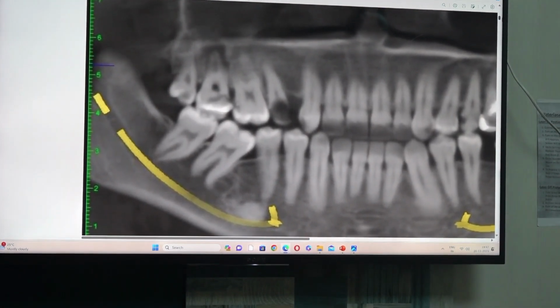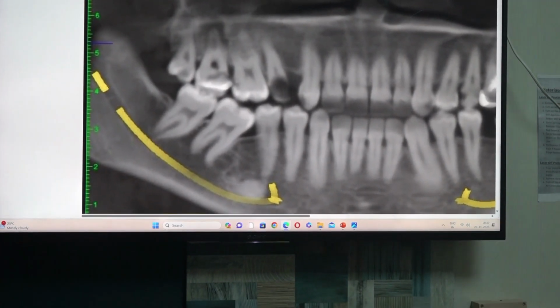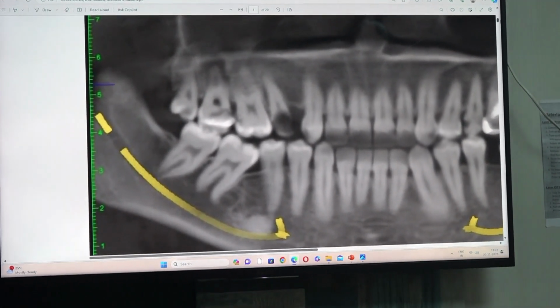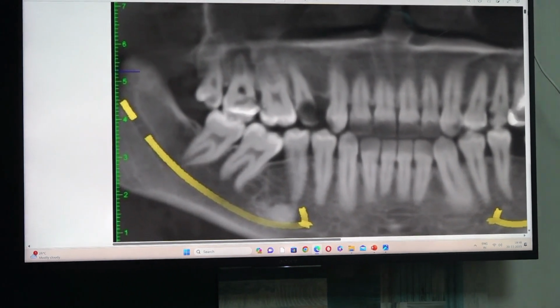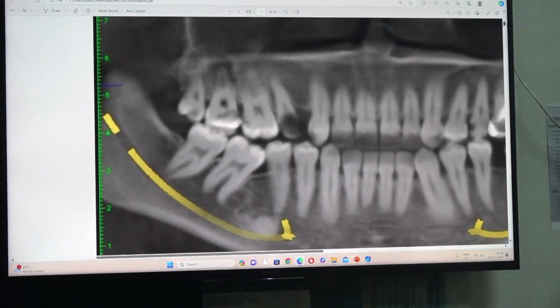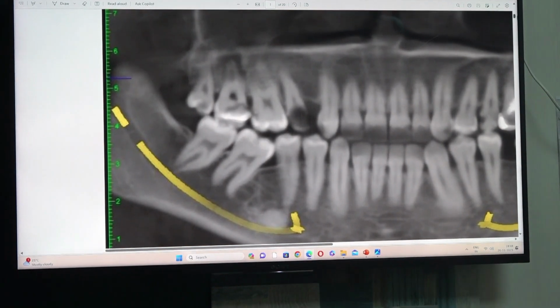But before placing the 7 implant, you have to place the pterygoid. If you place the 7 implant first, you cannot drill properly. You cannot place implant in the pterygoid region. So place pterygoid first, then come for the 7 implant. Okay. Some doctors do the pterygoid first, because that is a challenging one. They do the pterygoid first, then they can do the other implants.